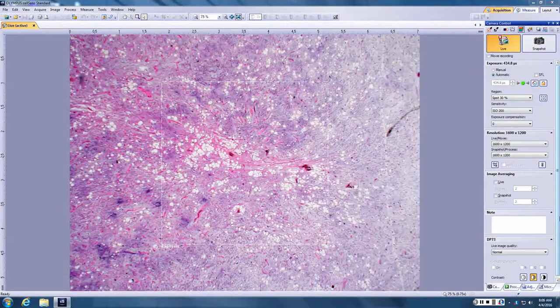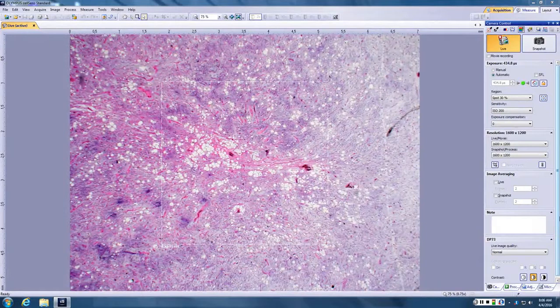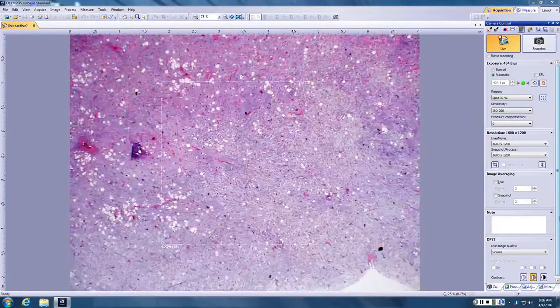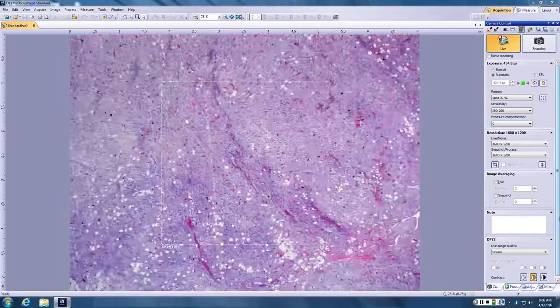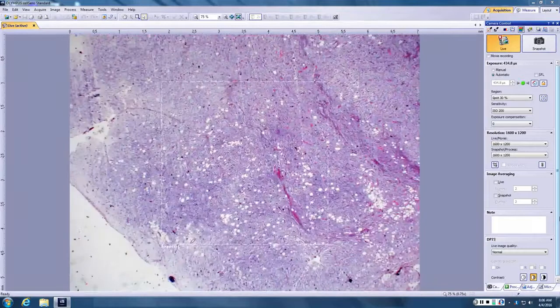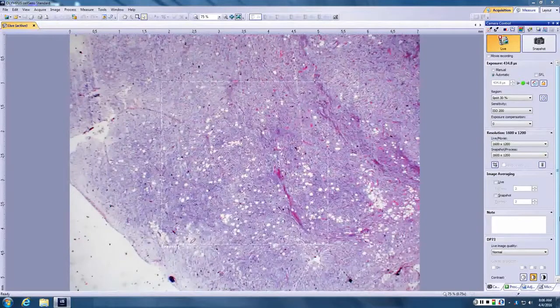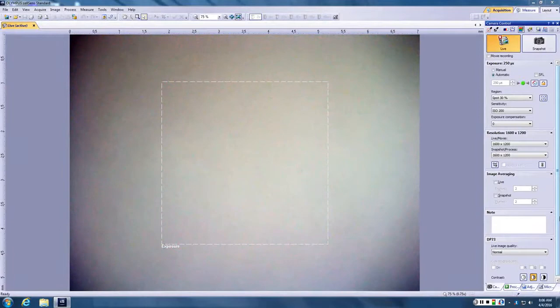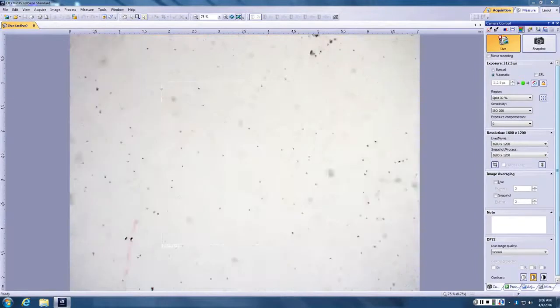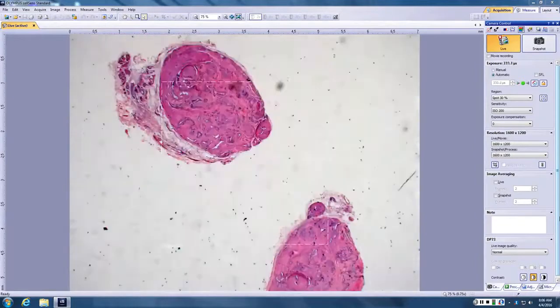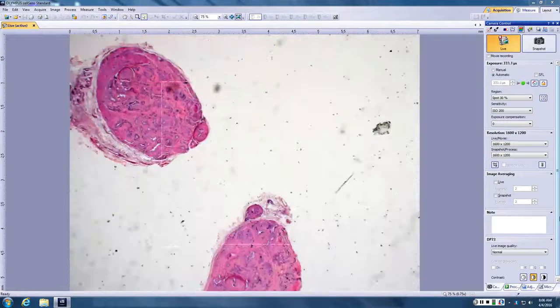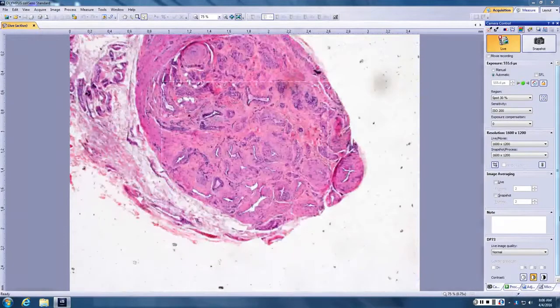So very good, so there are lipocytes. I'd say probably more than 5% here but it's not... they're not tons of lipocytes. There is more myxoid change, ropey collagen, but again it fits nicely into that whole spectrum of spindle cell lipoma. Again they're quite common, everyone's a little different, so they are entities that if you were looking for something to test would probably distinguish well, discriminate well.